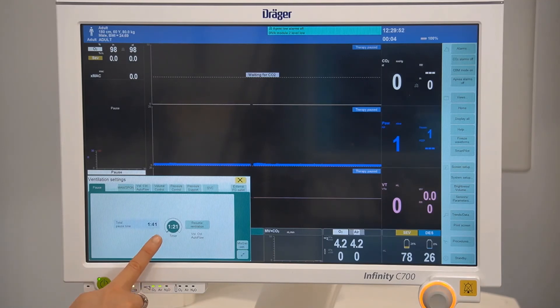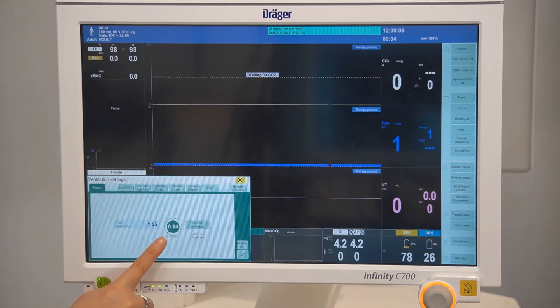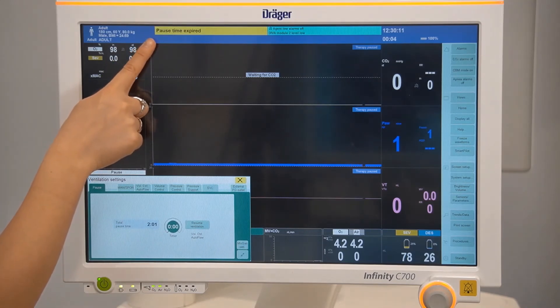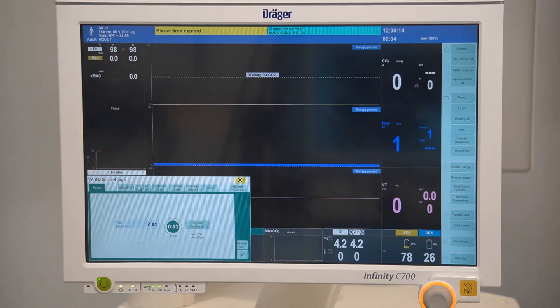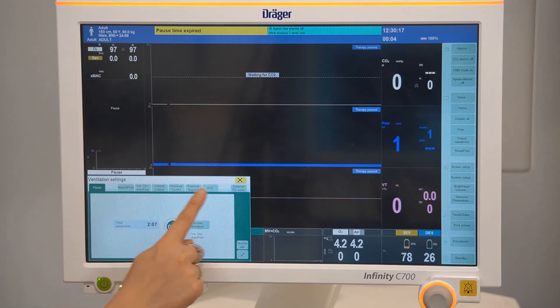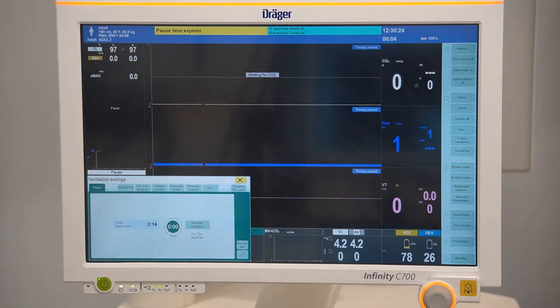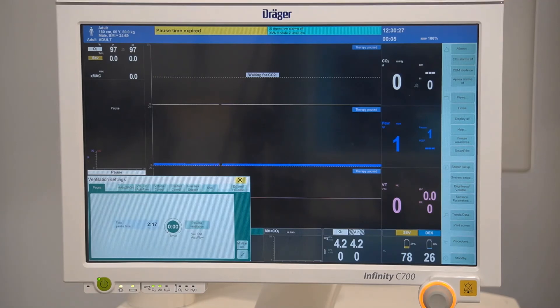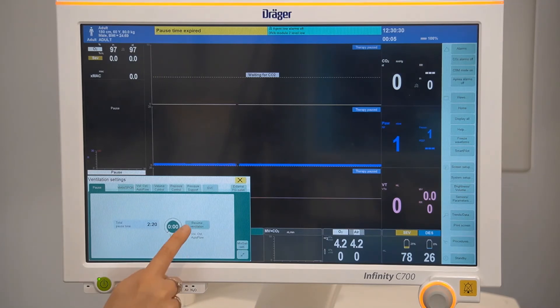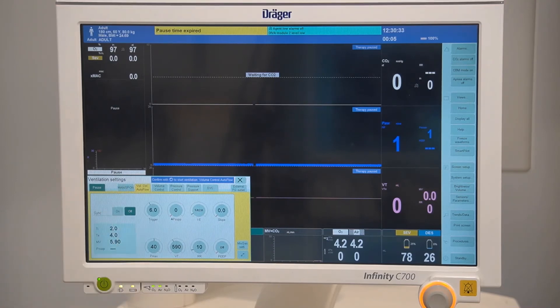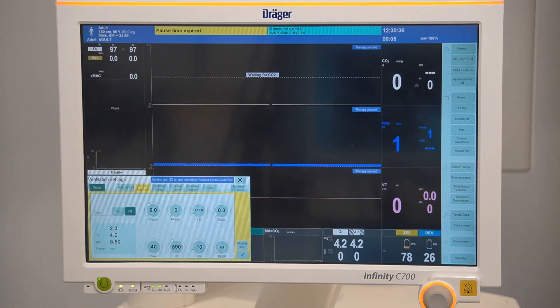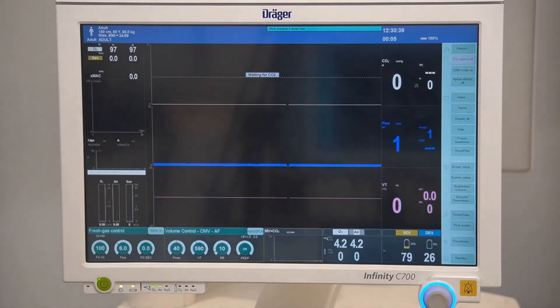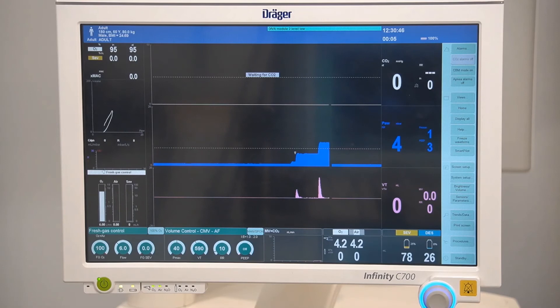A safety time limit will also be triggered during pause mode. When the timer runs out, a message confirming pause time has expired will be displayed. Until you resume ventilation or select from the available vent modes, fresh gas delivery and mechanical ventilation will not resume. Selecting resume ventilation will take you to the previous ventilation mode prior to pause being activated, and will also hold your previous ventilation mode settings.